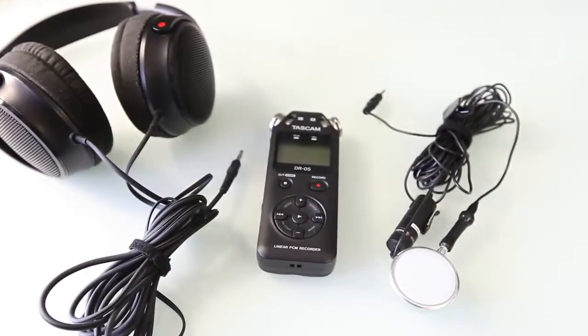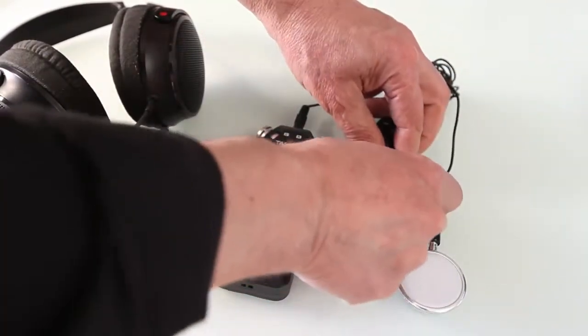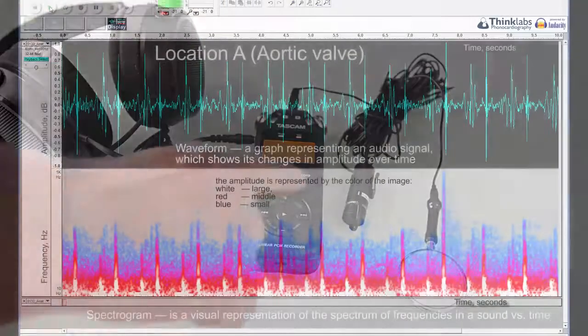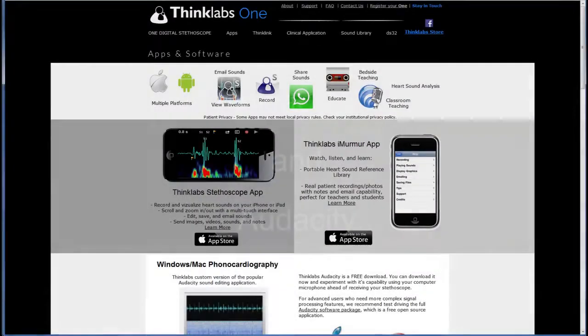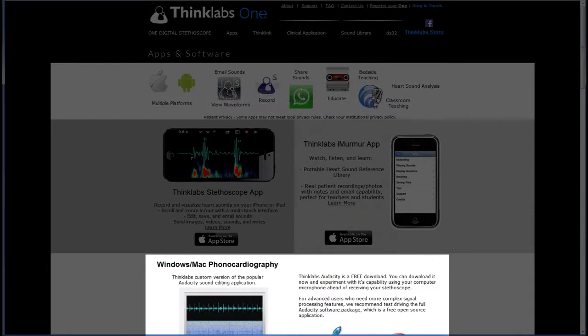Now we will connect the stethoscope head with a microphone to the recording device. Our electronic stethoscope is now ready for recording my heartbeats. Later, I will view the waveform of the recorded sound of my heart. It is also possible to view its spectrogram — that is, a visual representation of the spectrum of frequencies in a sound versus time. The horizontal axis represents time, the vertical axis represents frequency, and a third dimension indicating the amplitude is represented by the color of the image. For recording and playing back, I will use Thinklabs Phonocardiography powered by Audacity software, which is free and can be downloaded from thinklabs.com.